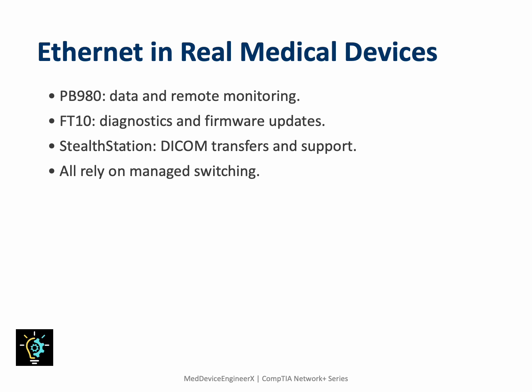Each of these systems depends on Ethernet. The PB980 transmits patient metrics through hospital networks, while the FT10 allows engineers to update software over Ethernet. StealthStation connects to PACS servers using DICOM over secure VLANs. Each scenario relies on managed switches to separate traffic and maintain predictable communication.